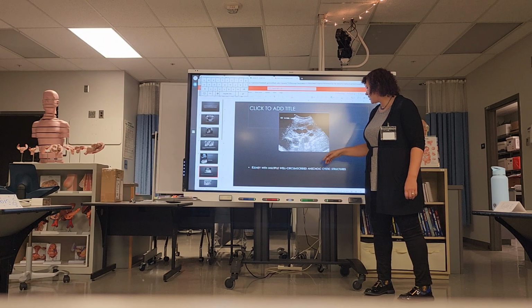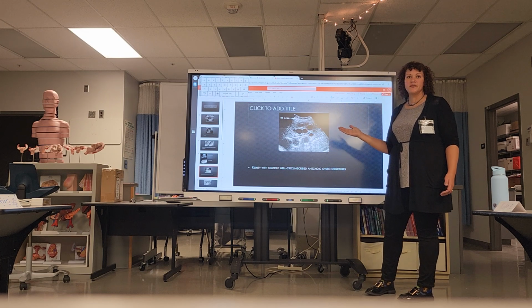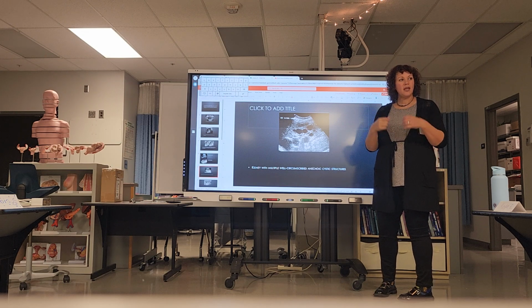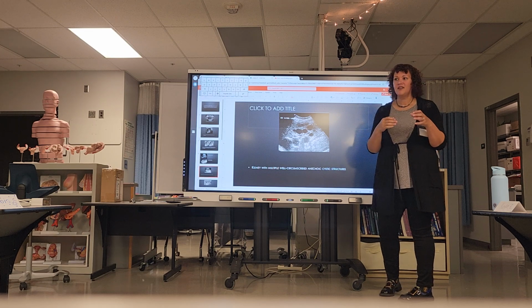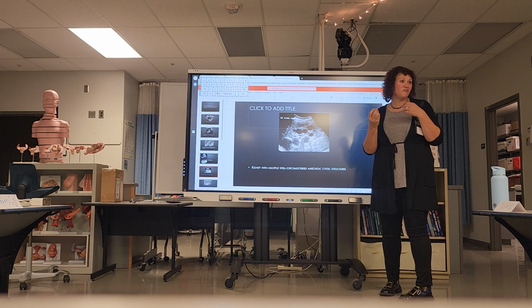You would describe it as multiple well-circumscribed anechoic structures, or cystic structures. So we're not going to describe something as being a cyst, but you can call something cystic. Cyst is a diagnosis, but cystic is just kind of comparing it to cyst.